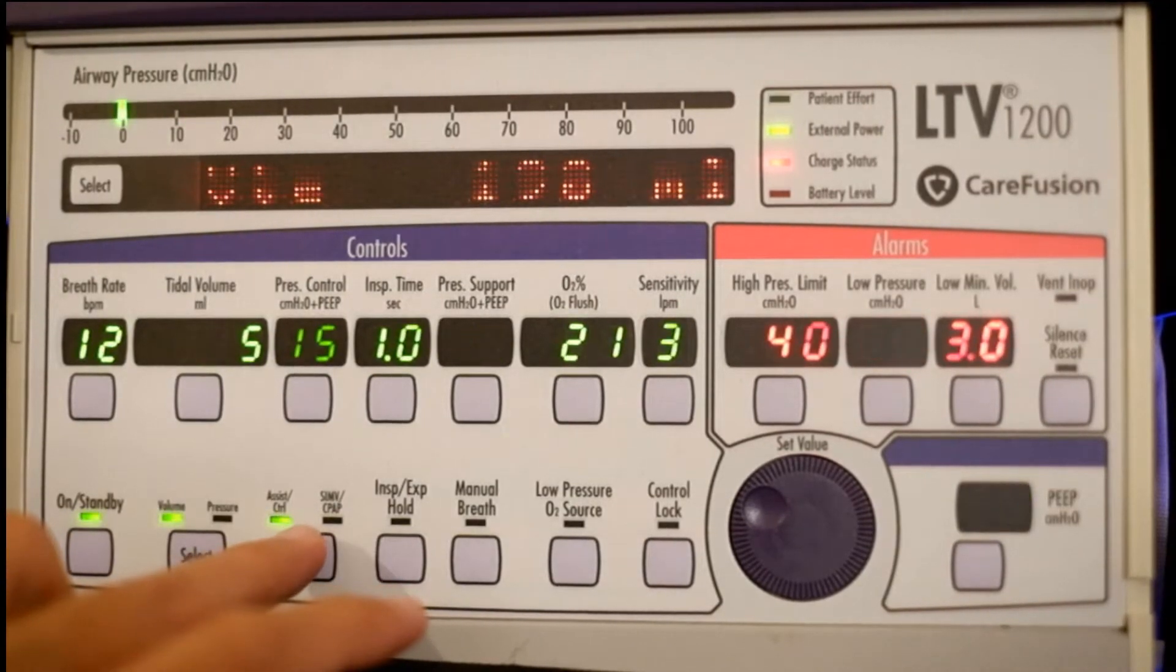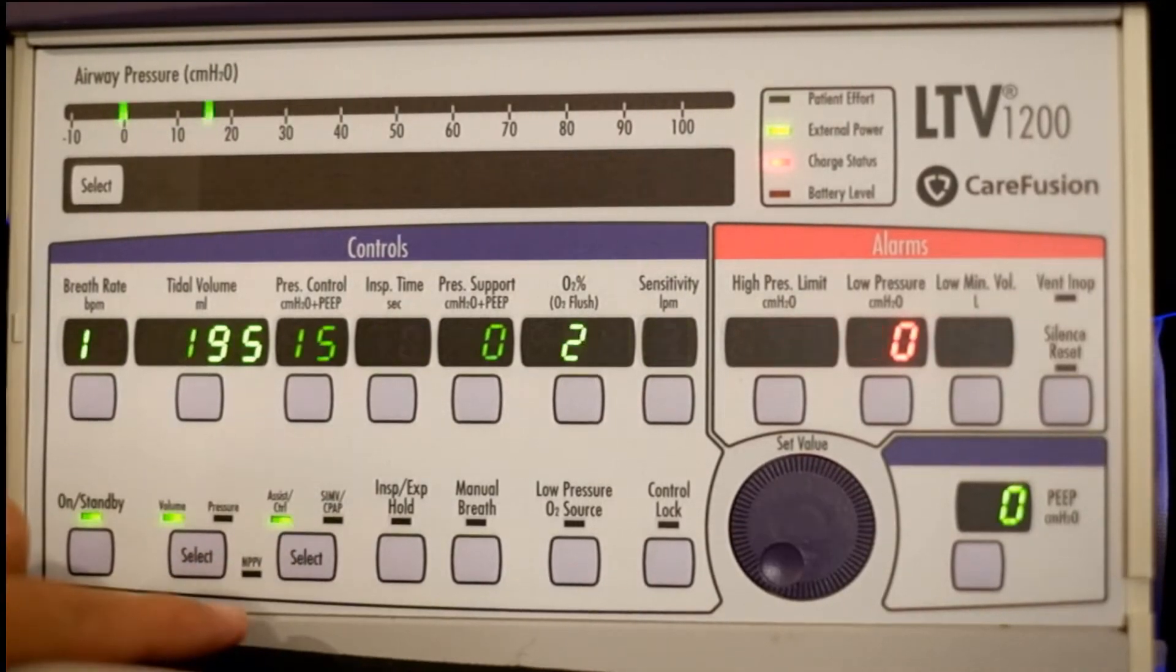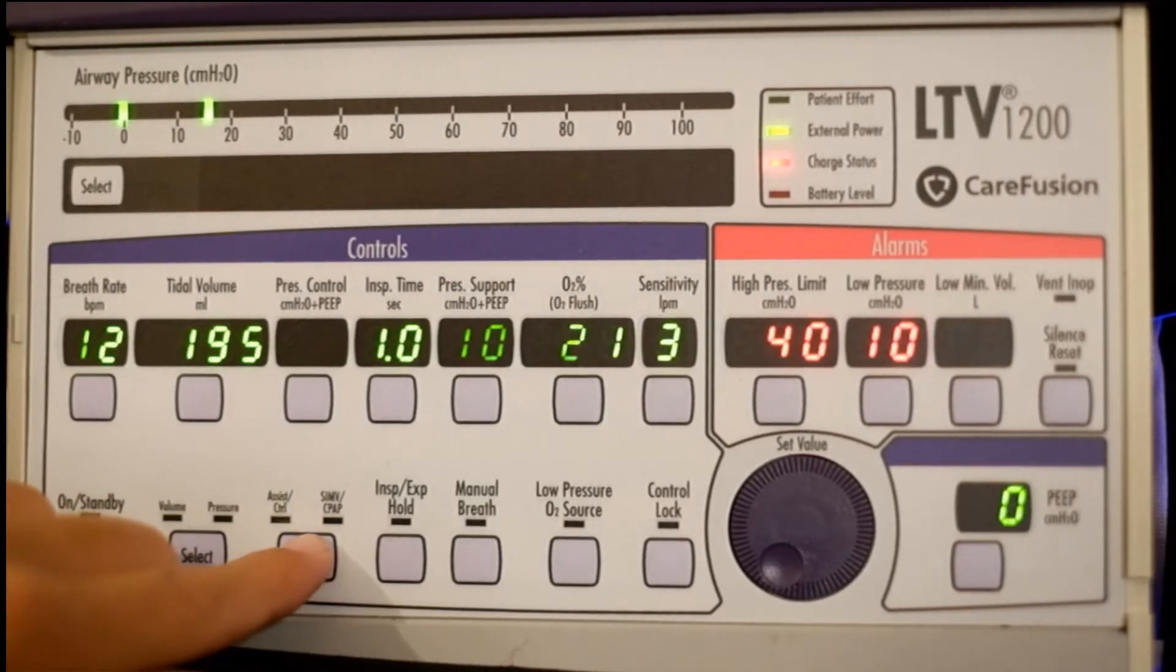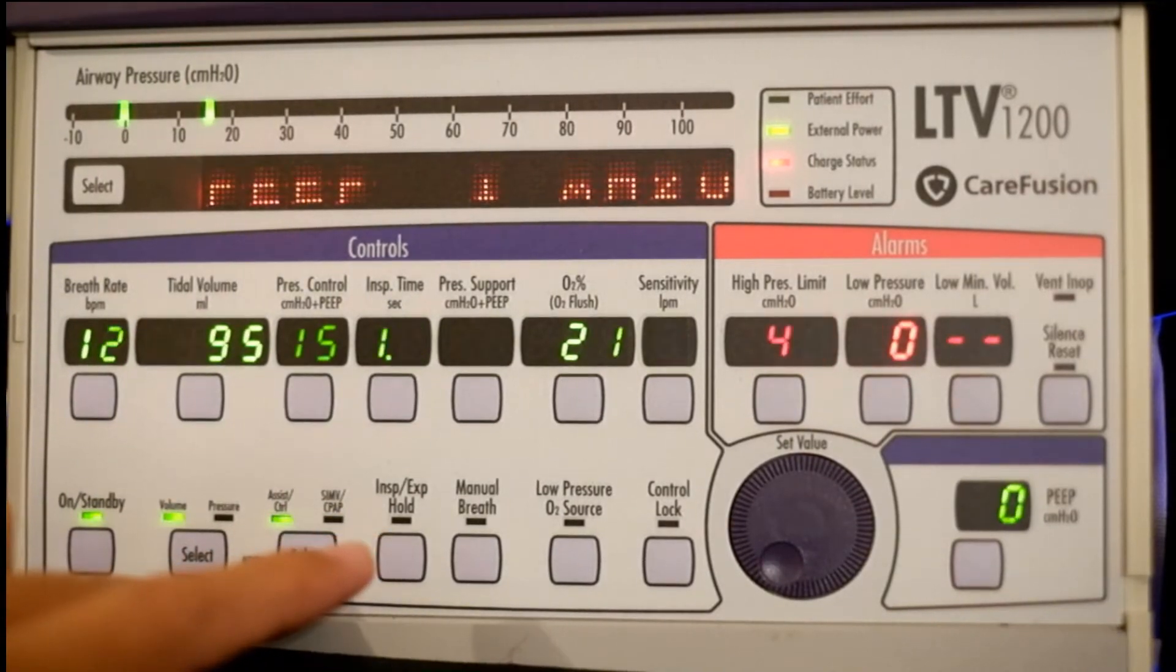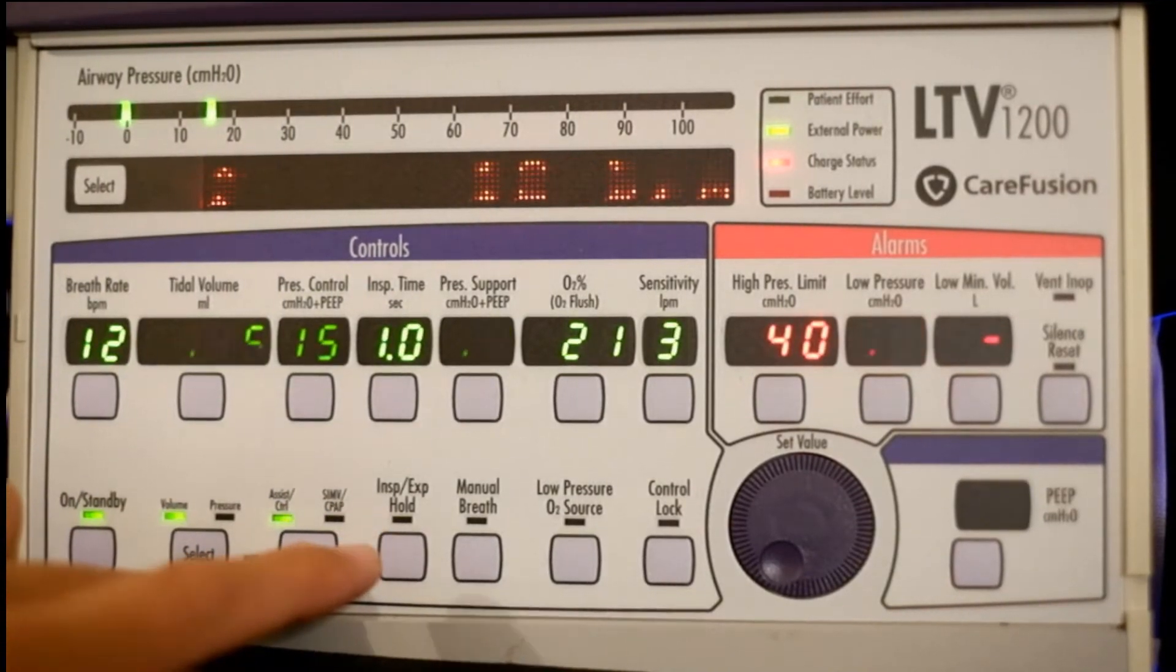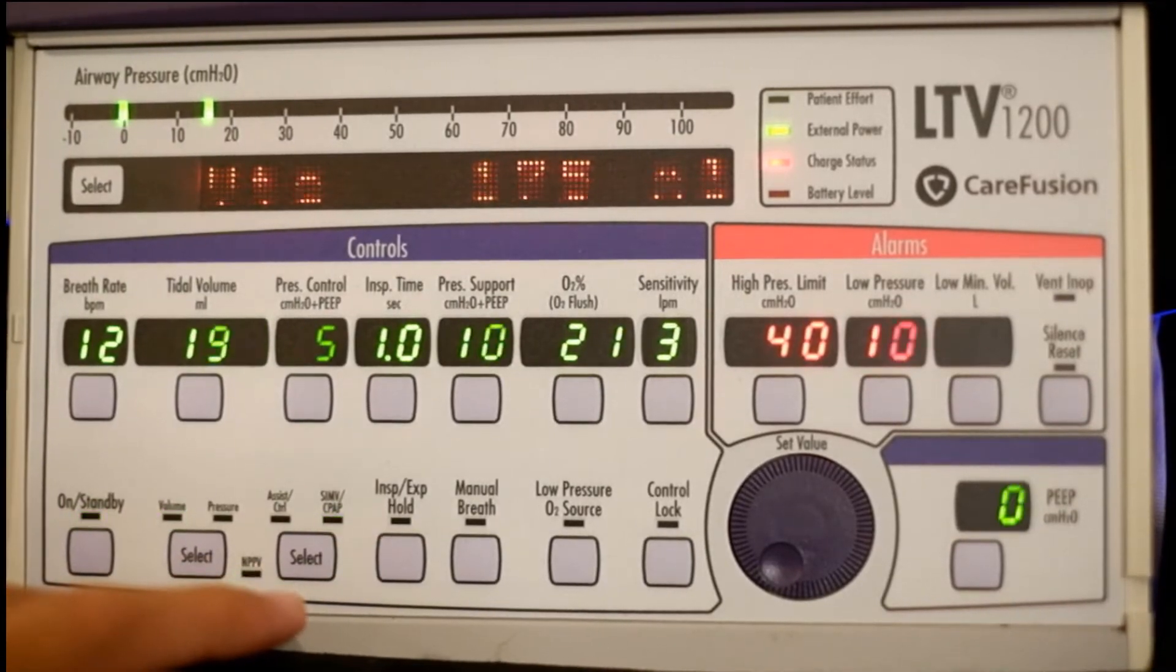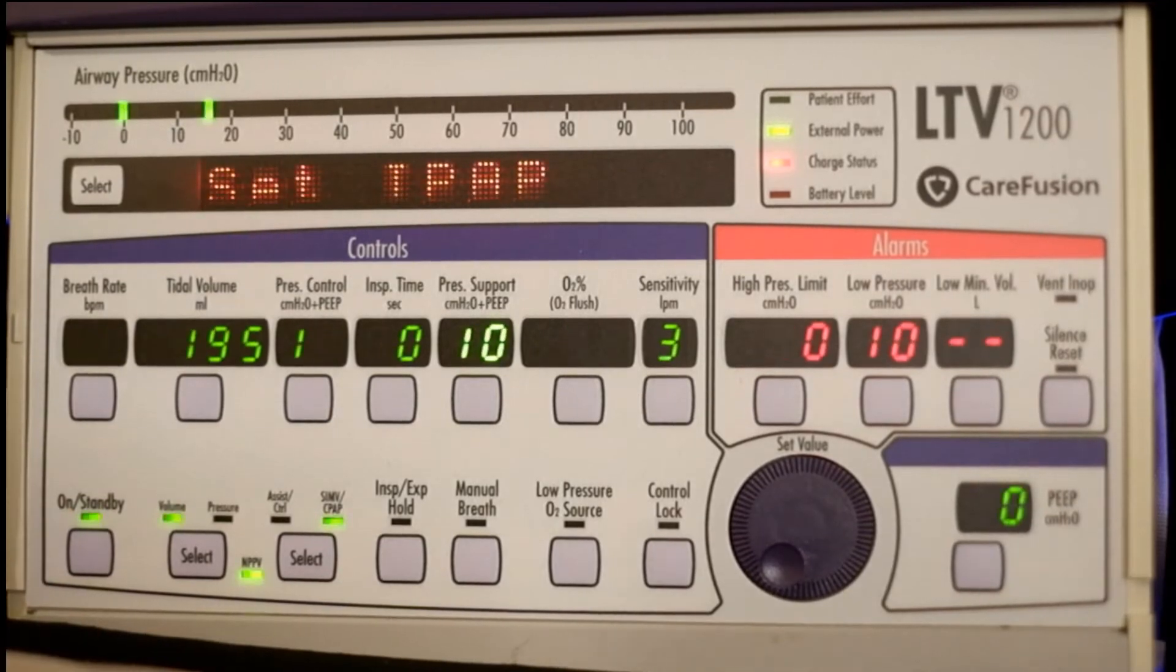Assist control, SIMV CPAP, and NPPV - non-invasive positive pressure ventilation - is what we want. We're going to have to press the button four times. So we hit it once, it's blinking on SIMV. Hit it again, that's two. Hit it again, it's now blinking on NPPV. Hit it again, and now we're on BiPAP.